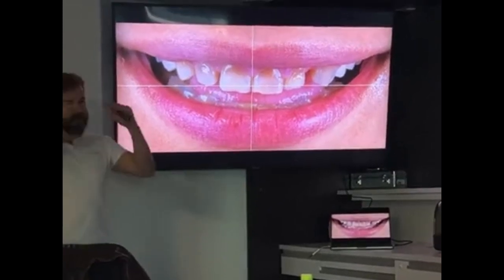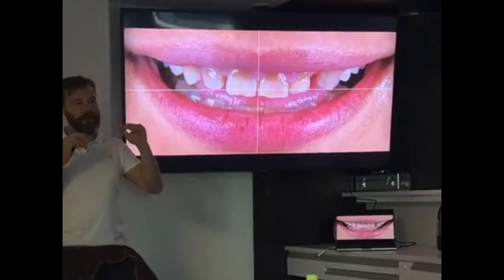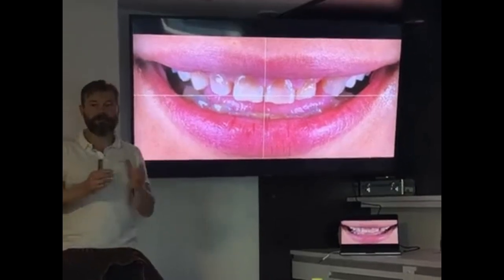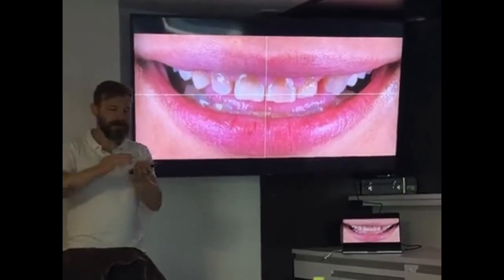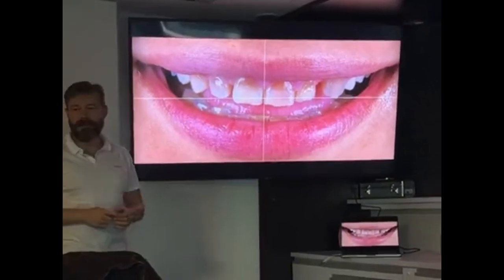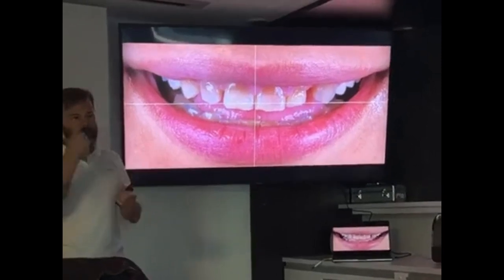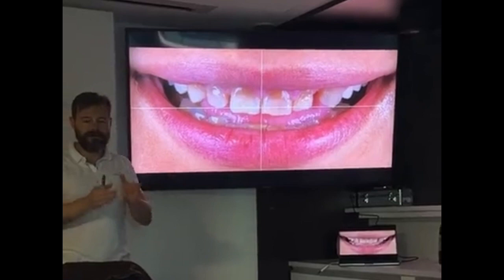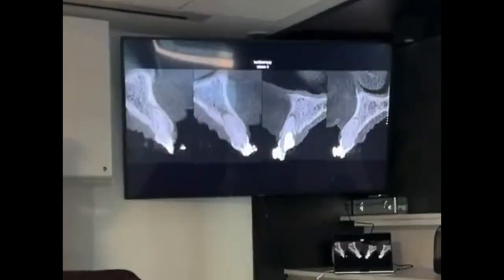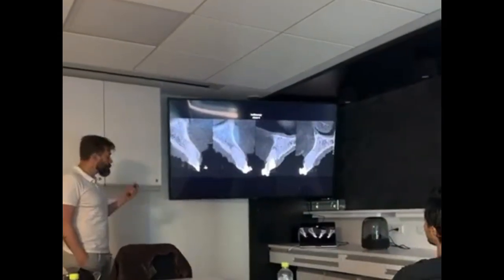Because in a few cases you're going to have a small difference in the tissue formation, for less or for more, and I need to change this tissue. I need to design a zenith, I need to design a triangular shape. Sometimes I have too much tissue that I really need to push up. And here in this case, you're going to start to understand how to do the conditioning stage for more than one crown, right? In the end of the day, you're going to get full arch conditioning as well. So this was a case that for me was very rare and interesting to treat.